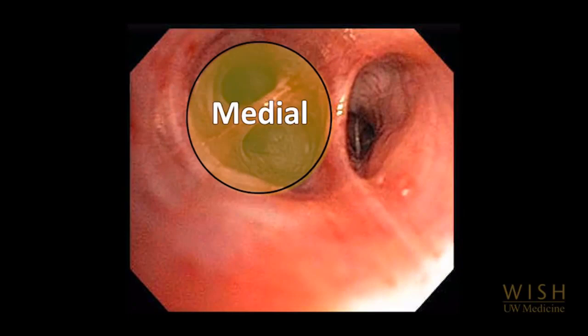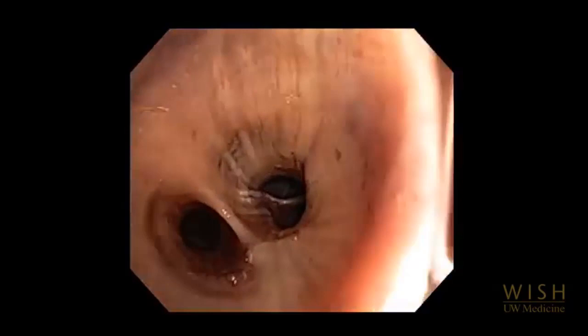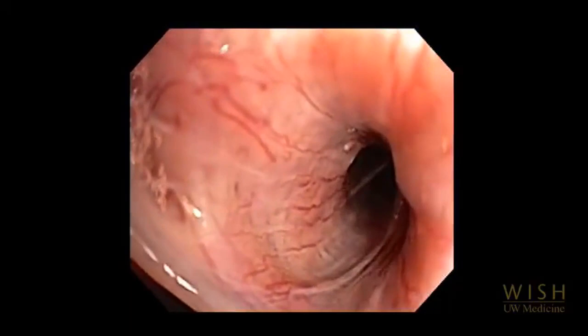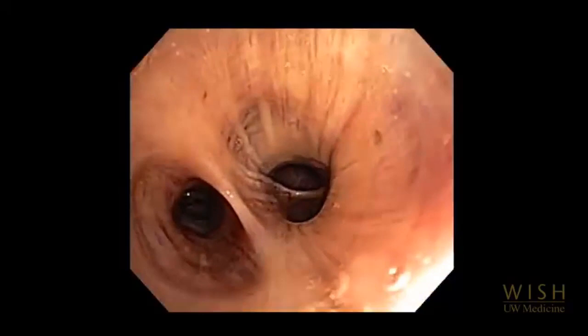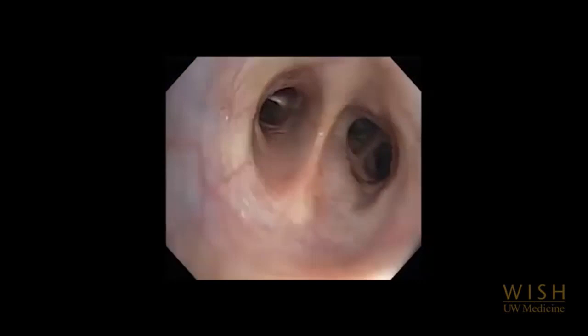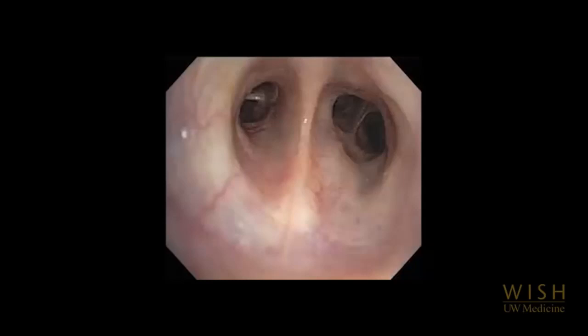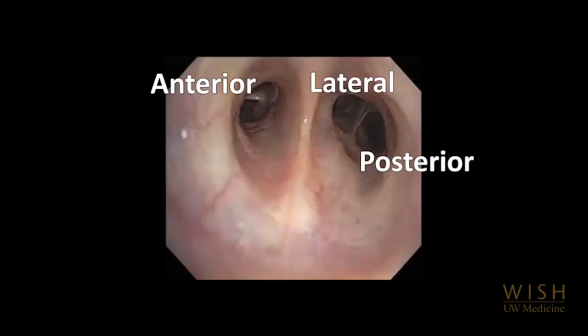The right middle lobe has two segments — medial and lateral. We then inspect the superior segment, and then the medial basal segment. We are continuing our anatomy demonstration in a different patient, where inspection of the right medial basal segment has just been completed. We now see how the right lower lobe bronchus divides into the remaining basilar segmental bronchi — anterior, lateral and posterior. These are typically in a row when the bronchoscope is held in an anterior-posterior orientation within the right lower lobe bronchus, forming the familiar ALP mnemonic.